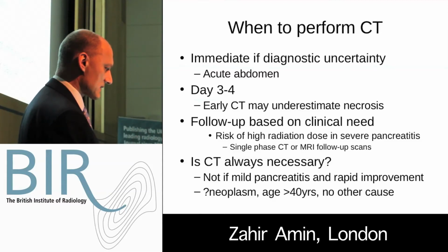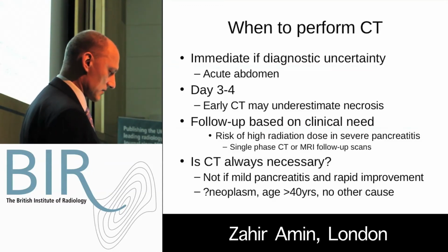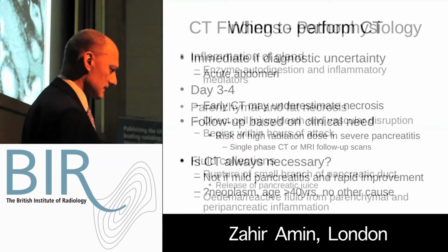Is CT always necessary? If there's very mild pancreatitis and rapid improvement clinically, then it's not necessary to perform CT. And there's a proviso in patients greater than 40 years of age. Sometimes pancreatic cancer can present with acute inflammation, and if there's no other cause apparent, CT should be considered.